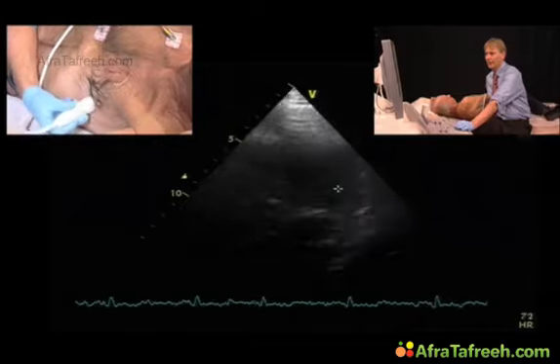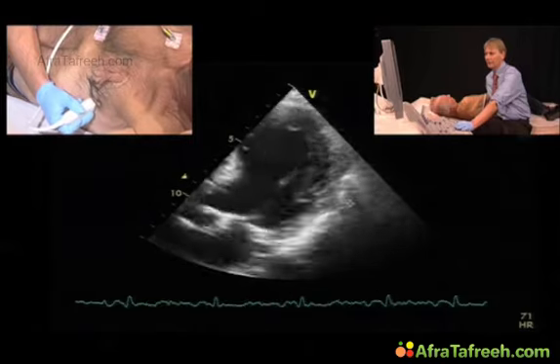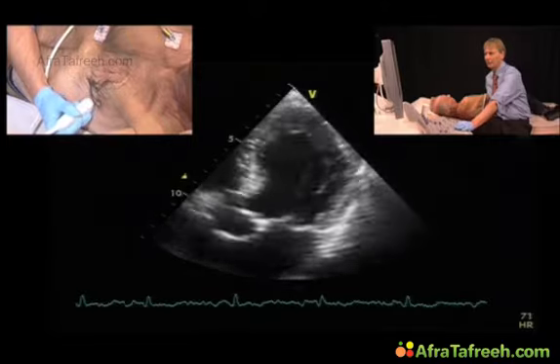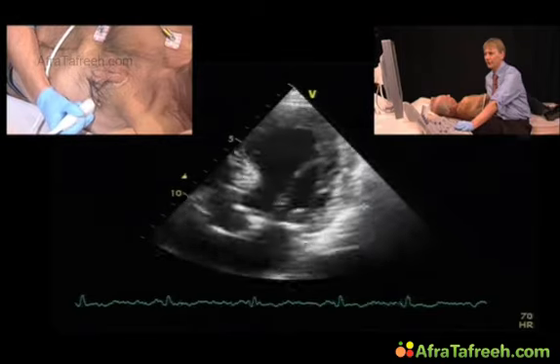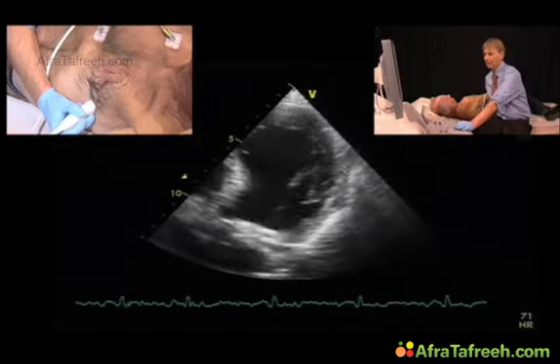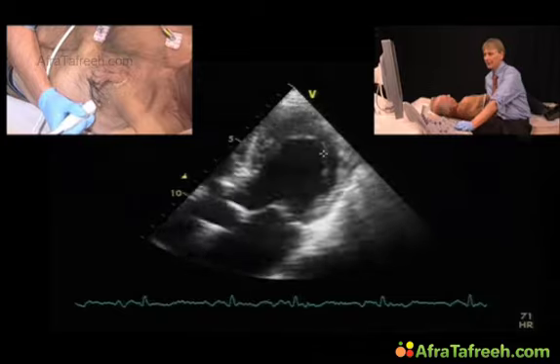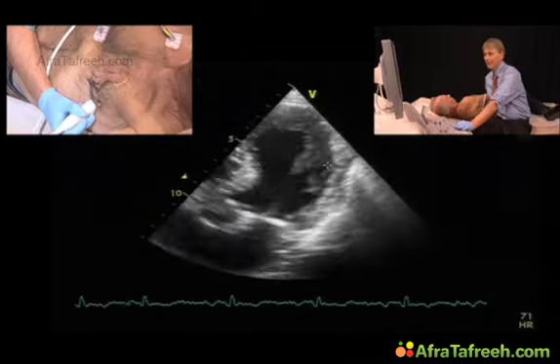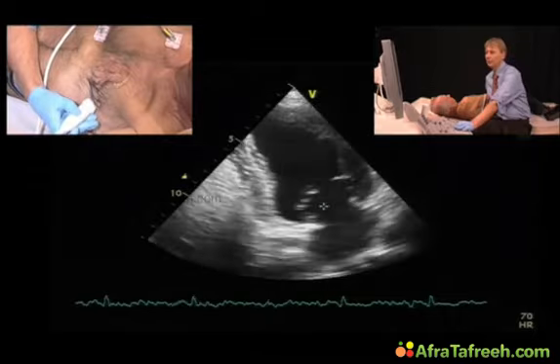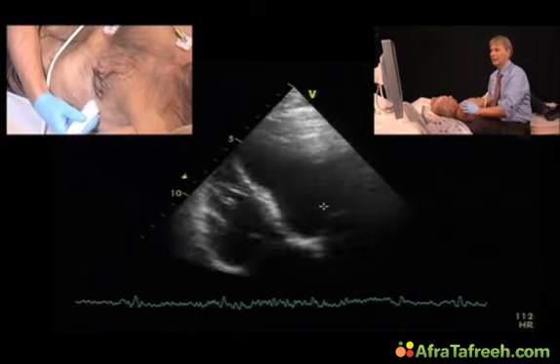And to really look at the entire myocardial function and the entire regional wall motion abnormalities, it's always good to also look at the view where you rotate the transducer from the four-chamber view clockwise towards the lateral wall here. So again, you see regional wall motion abnormalities here all the way to the mid-lateral wall, which means that there is an infero-posterolateral infarct. Very important is always to look at the other regions of the myocardium very closely.